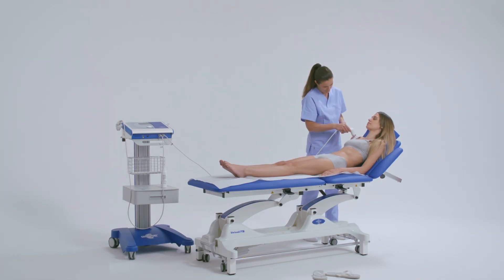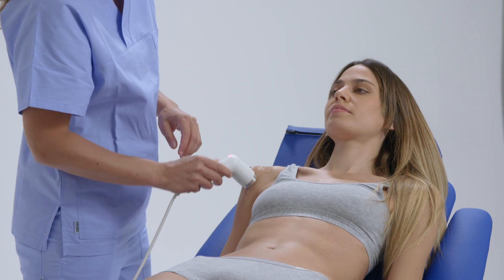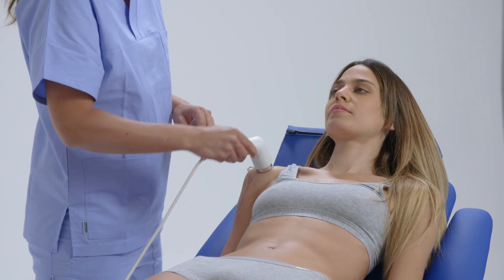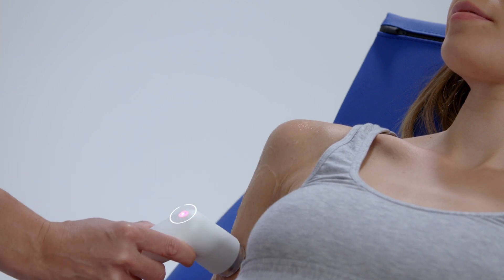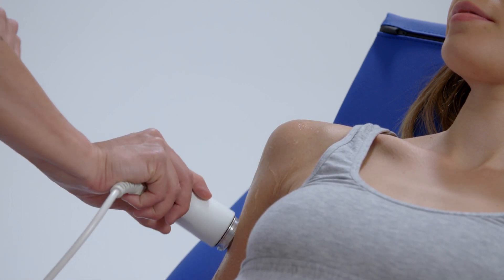The treatment should be carried out with the handpiece always moving and firmly attached to the skin to avoid overheating the skin in the treated area. The red light at the top of the handpiece indicates the emission is in progress.